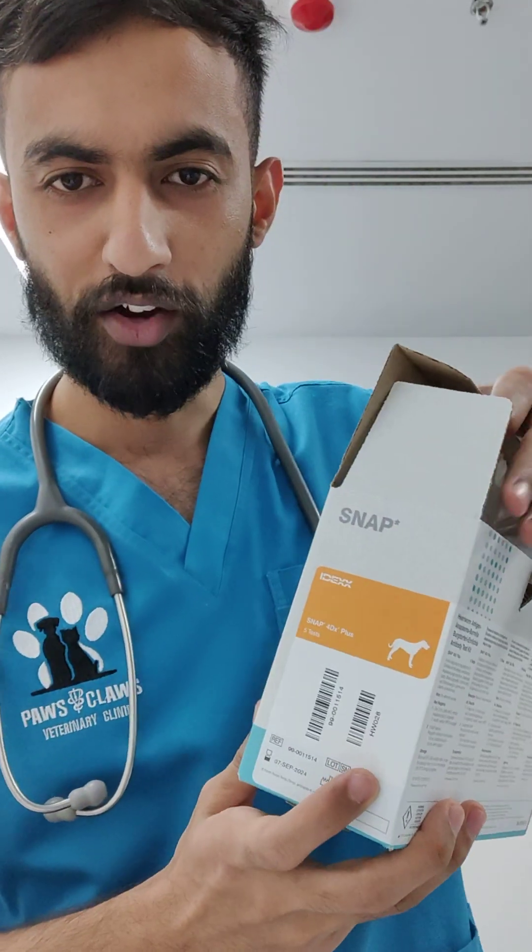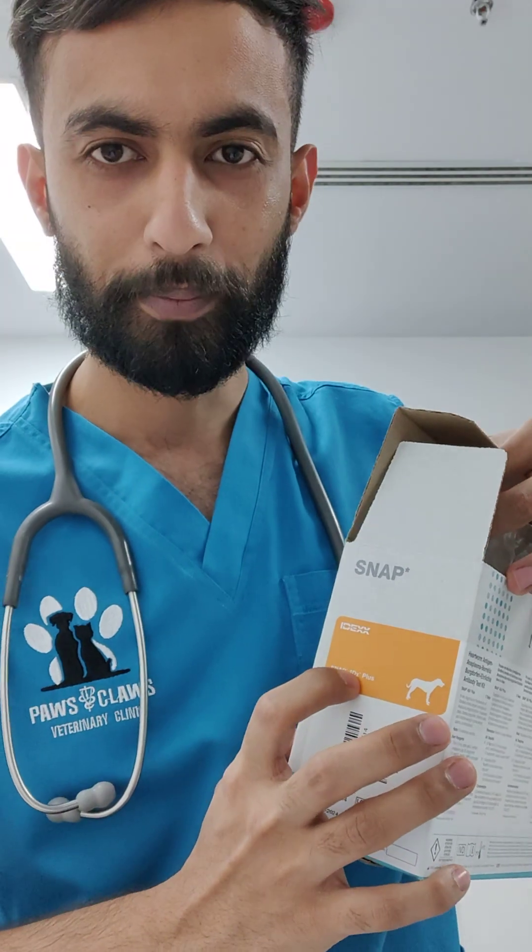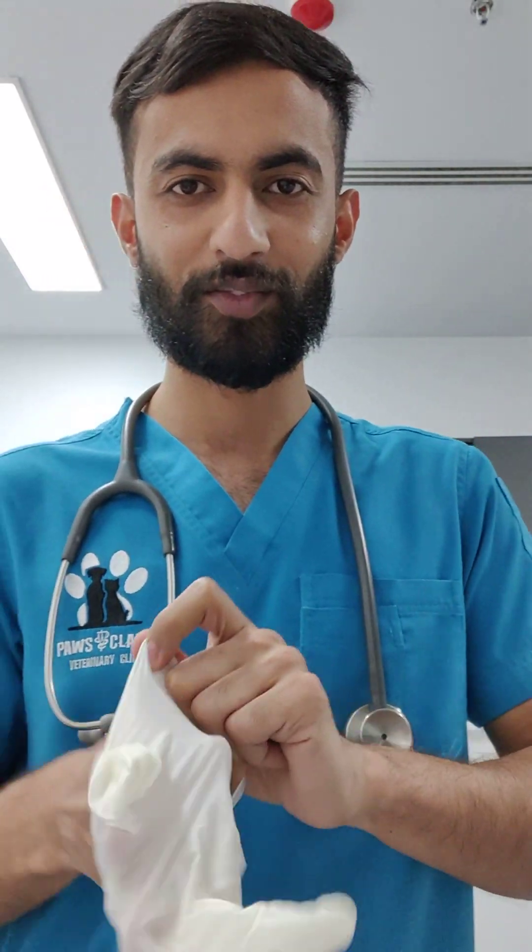Hello, welcome back to our video. Today we are going to show you how you can do the 4DX plus IDEX test Snap Pro. We are going to show you how to do it step by step. You can wear the gloves first.